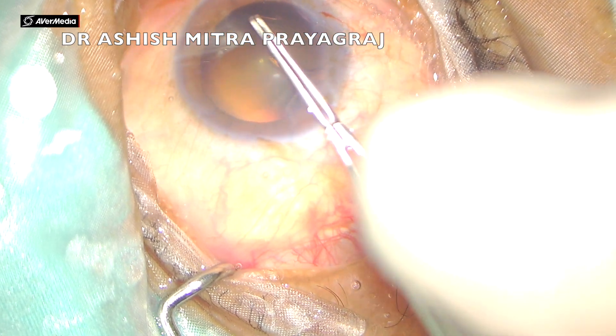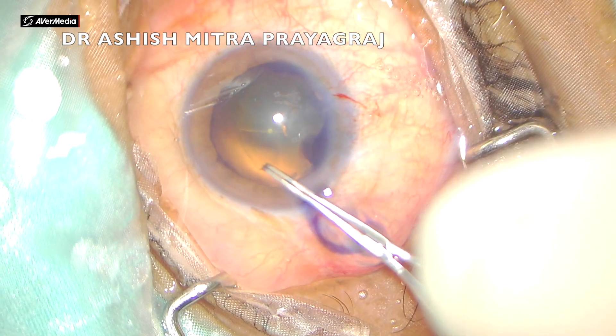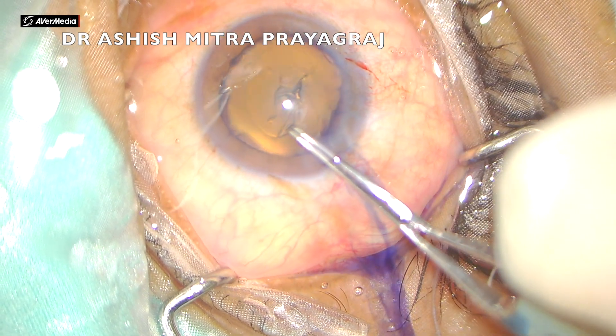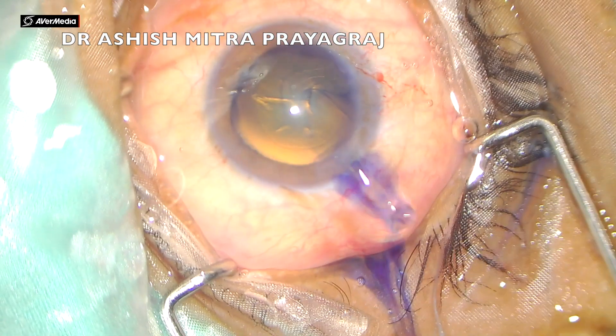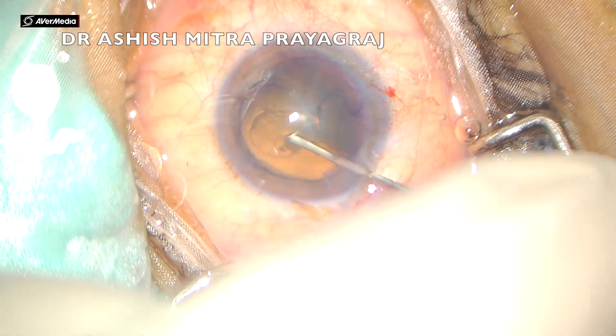With Utrata forceps I always go with both limbs closed, just rub onto the capsule, and then make the rhexis. The initial flap is taken outside to the diameter of rhexis I require. For beginners, I would suggest making a larger rhexis in cases of soft cataract, because you may need to flip the nucleus.